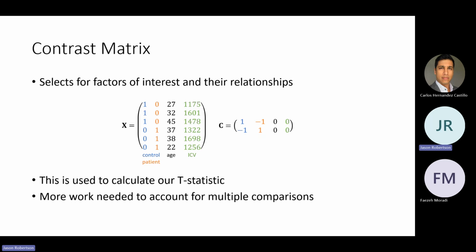So this equation, you run it in every single location. If you have 30,000 voxels, that equation is calculated 30,000 times. That's exactly where the multiple comparison correction happens, because Bonferroni says, if you run one test, this is the amount of significance that you want.